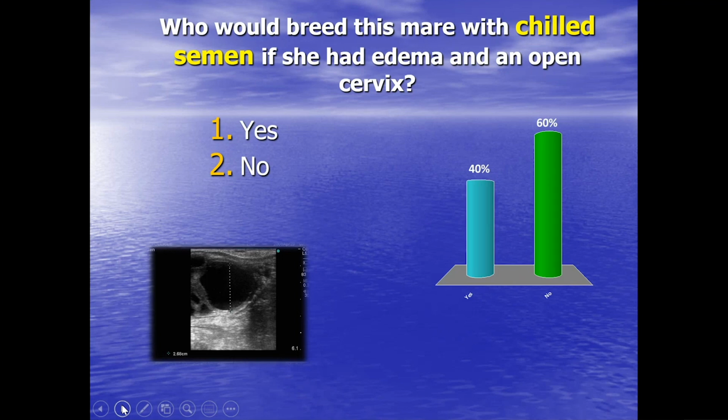And I may change into the 60% saying no. This time I'm not going to order the chilled semen. There's cost to ordering the chilled semen. We're just going to have to see what this follicle does, because I just don't know whether it's going to hang on or not. It's a little bit unusual. It's a small follicle with some shape changes. So I think, well, I'll sit tight before ordering.